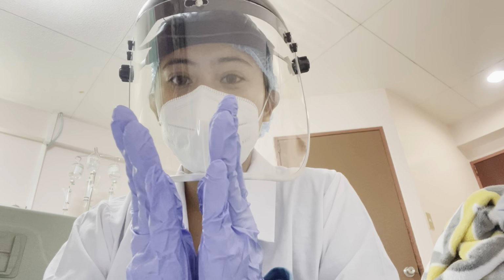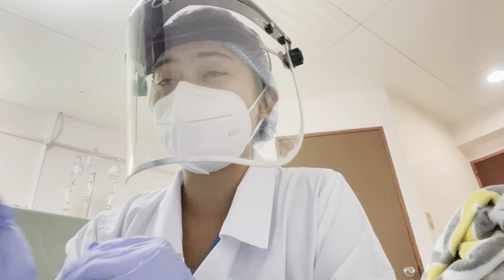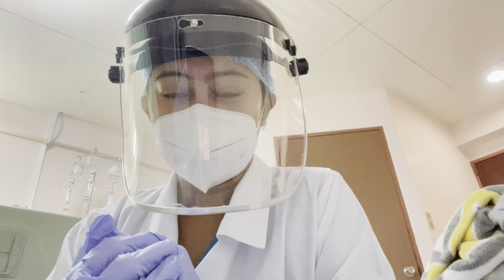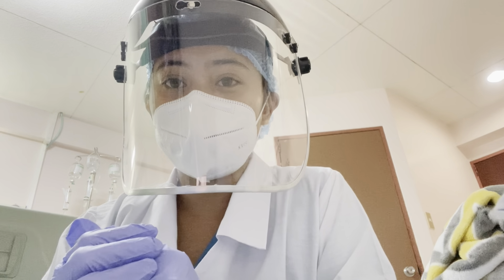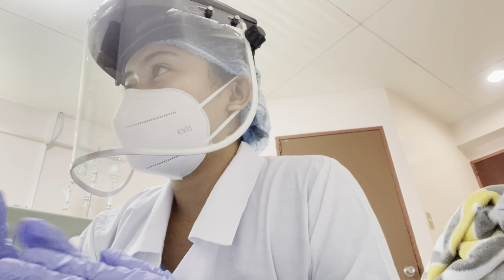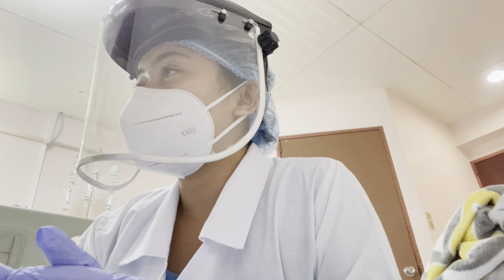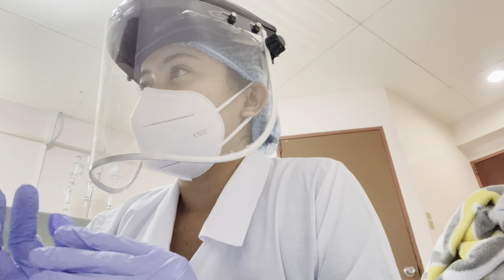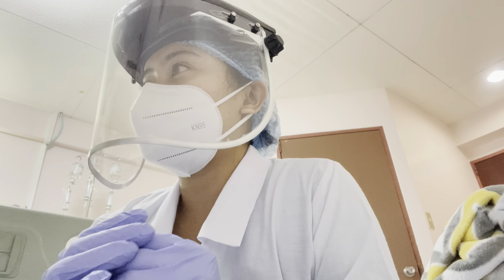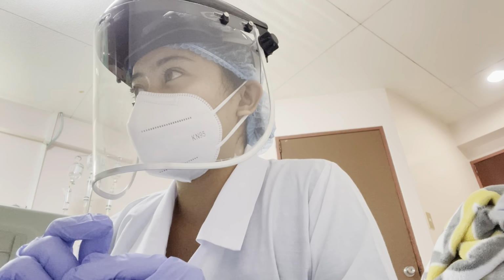After donning clean gloves, we have to make sure that we also remove any contact lenses from our patient if he or she is wearing them. Now, having contact lenses while doing the procedure might cause an infection. Ms. Suarez, are you wearing any contact lenses right now? Oh, okay. Now I'm going to need you to remove it for me because to do the eye irrigation procedure, we must remove the contact lens since it will just create an infection.